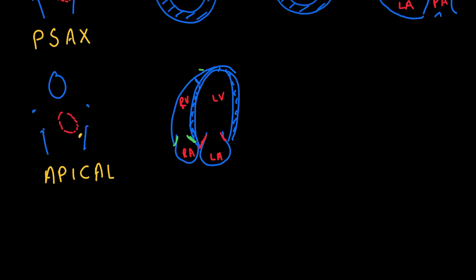So if you look at the length of your right ventricle versus the length of your left ventricle, I've exaggerated it a little bit here, but you see how the left ventricle is actually a little bit longer. So that insertion of the mitral versus tricuspid valve is very helpful in knowing which ventricle is which, particularly in congenital variances in anatomy.